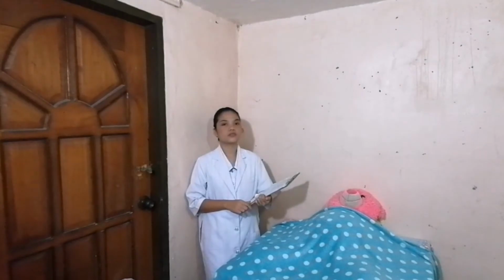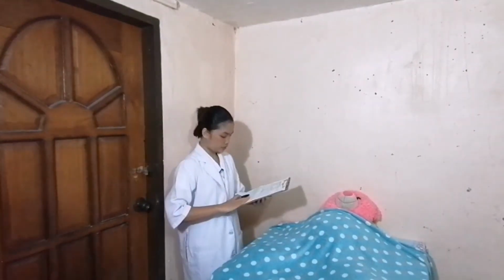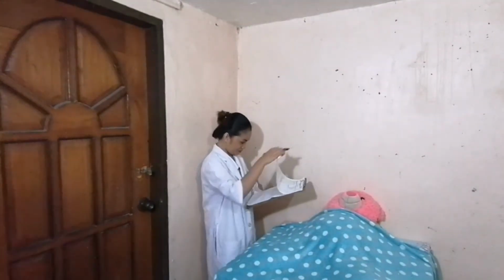And so the first procedure is to review the client's health record and check the client's chart for physician's order. Second is to identify the client and establish rapport. Third is to assess the need of the client for catheterization. And fourth is to explain the procedure to the client.